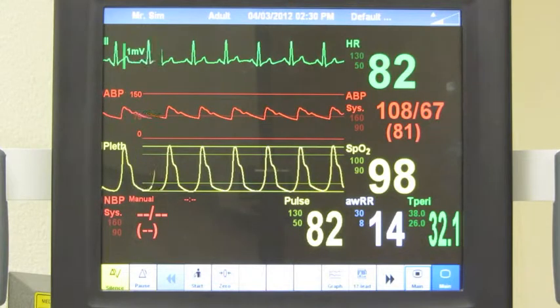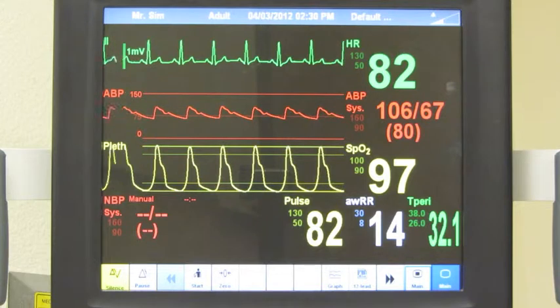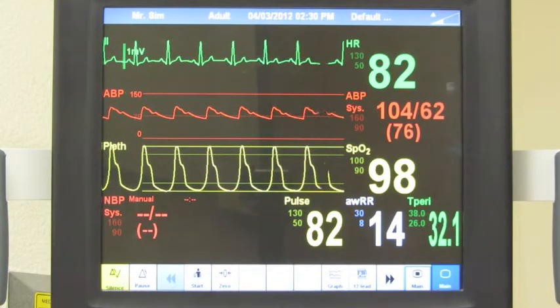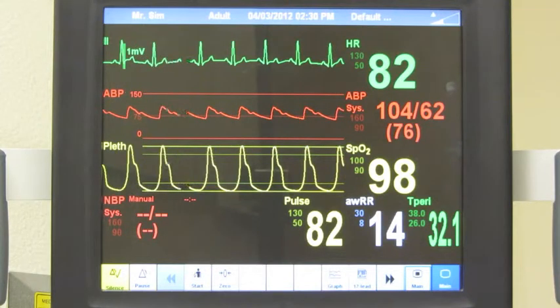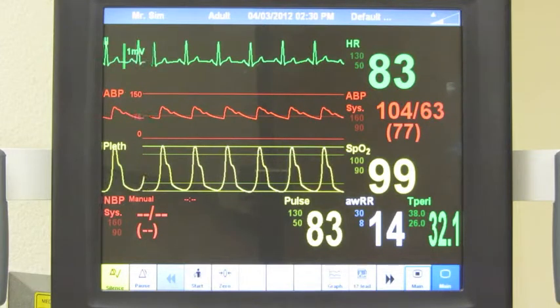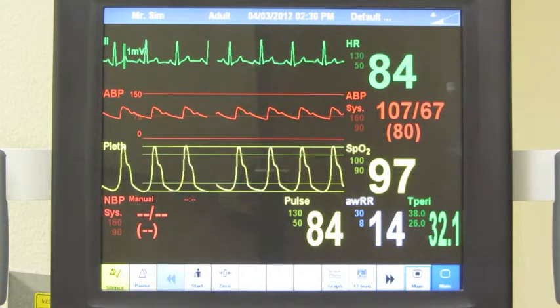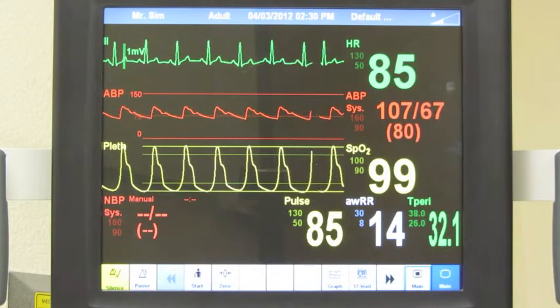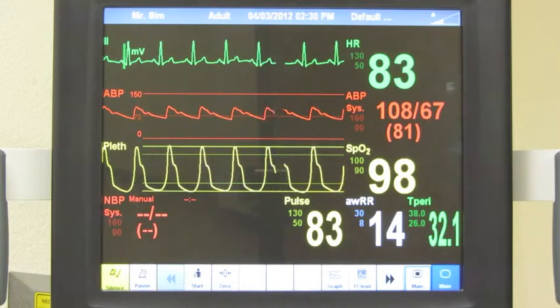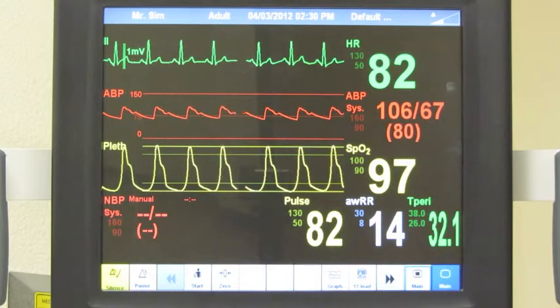As a result, if the SO2 saturation level drops below 90% at any point in time, or the subject experiences a drop in the SO2 of 3% or more, whatever physical activity is occurring should be discontinued at this point in time. You'll note in the particular scenario you were presented that there were minor fluctuations around the initial set point of 98%, so that you might have seen anything from 96, 97 to 98 or 99.